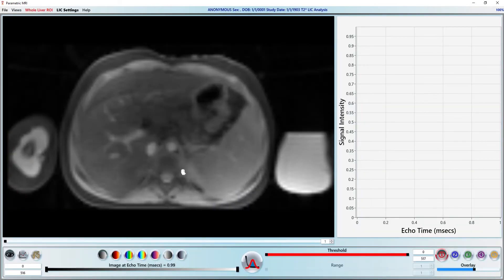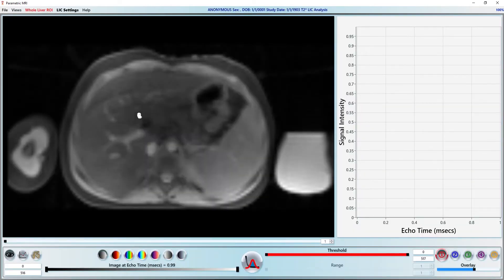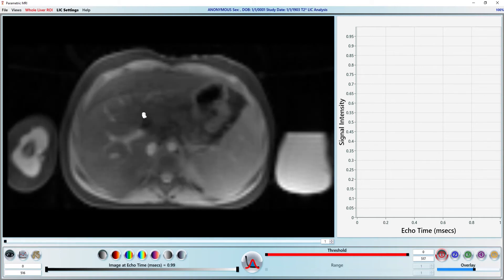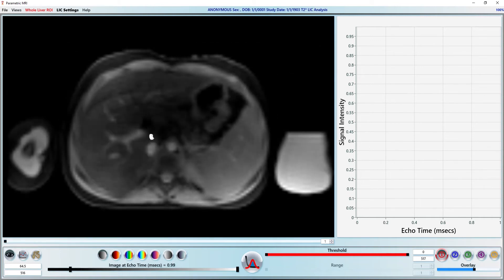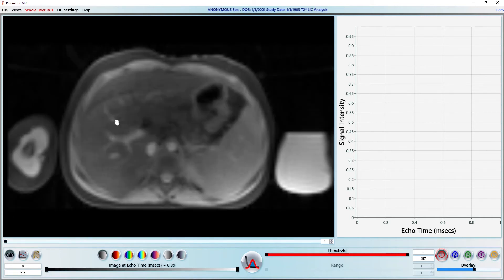This particular case has one slice with 12 echo times. We will see during the T2 example that everything works the same way for multi-slice acquisition. Our objective is to calculate the mean R2 star value of the liver and convert it into LIC units.